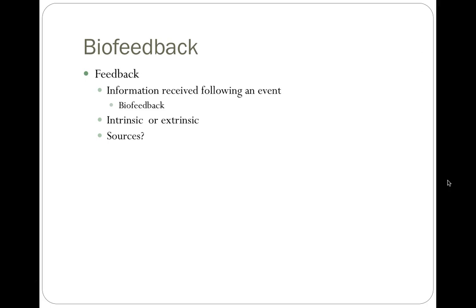Video cameras, recording someone. You guys did a motion analysis project for kinesiology. If you then viewed that with the individual, they would get biofeedback on their motions and how they're doing that particular movement pattern. Mirrors. We've had people do squats or activities in the mirror so that they can see the motion that they have, especially in their knee, right? Watching for that valgus.